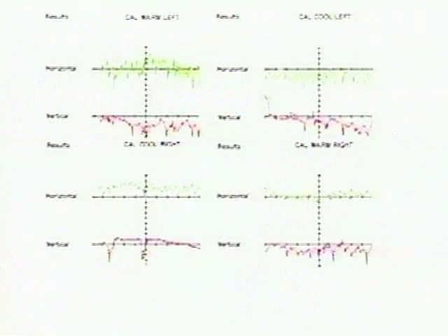The following patients' data are presented as additional examples of findings during caloric testing, both normal and abnormal. In the first two patients, we demonstrate brisk caloric responses in both ears, which are indicative of normal function.